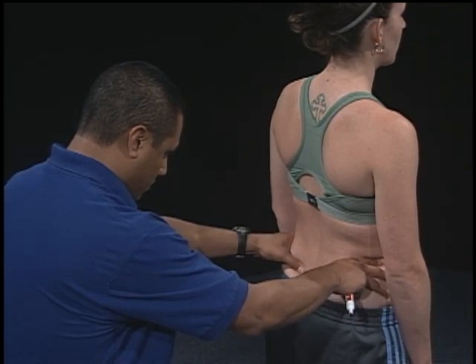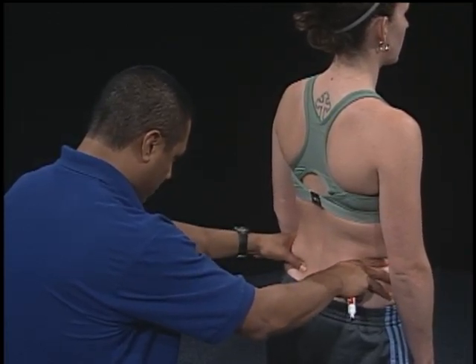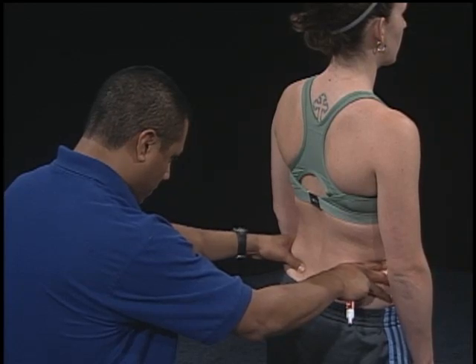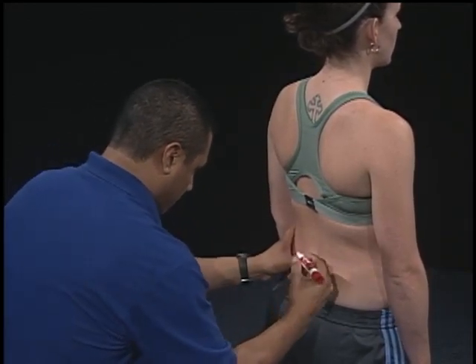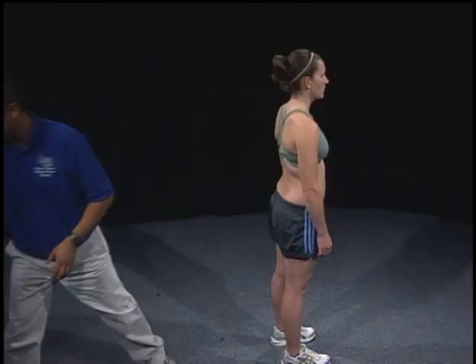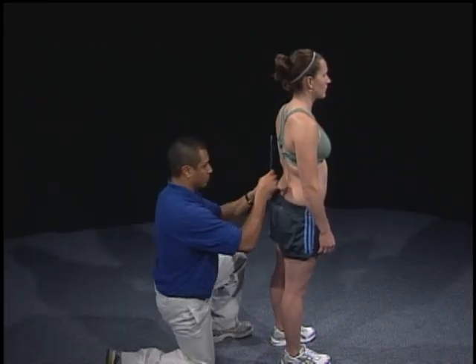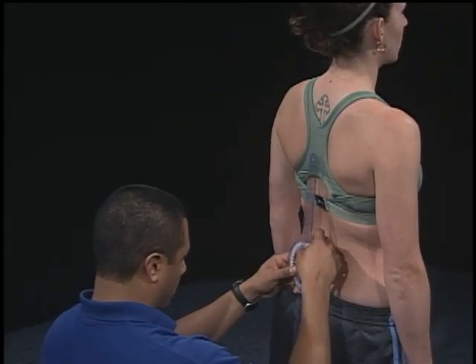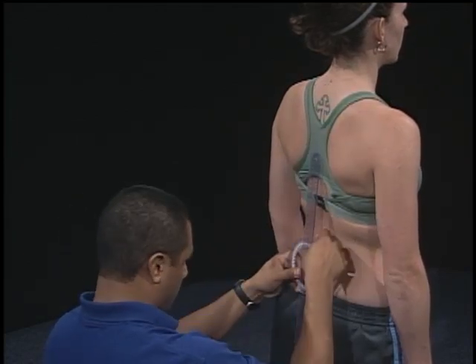Make sure you expose the bony landmarks you will be using. Use a skin marking pencil to mark the spinous processes of C7 and S1. Align the axis over the posterior aspect of the S1 spinous process. Align the stationary arm so that it is perpendicular to the ground. Align the movable arm with the posterior aspect of the spinous process of C7.